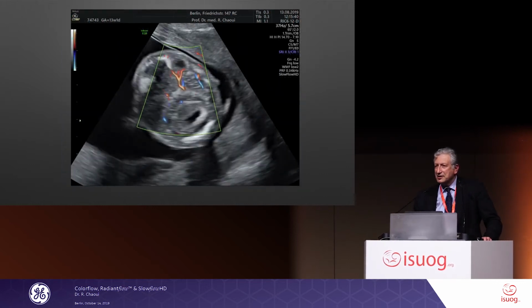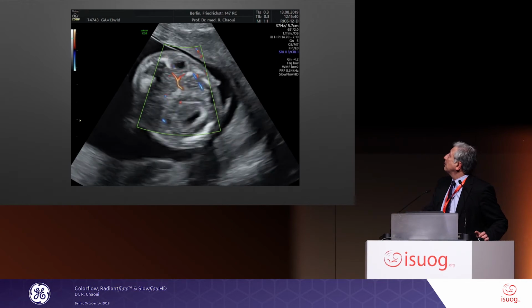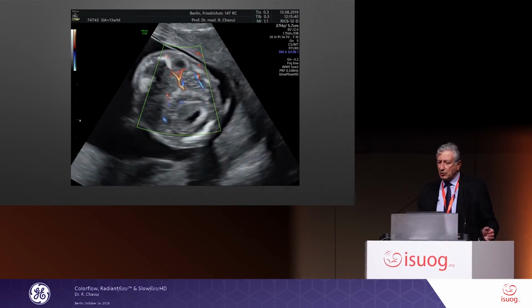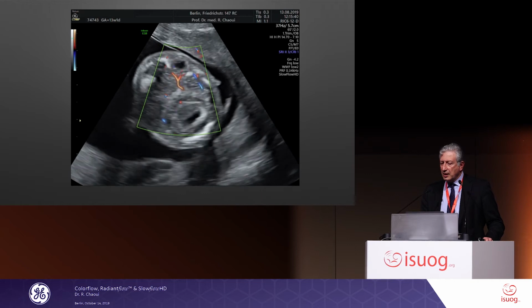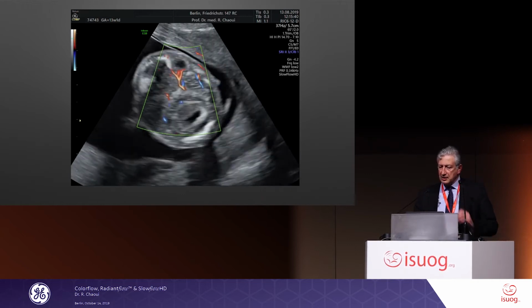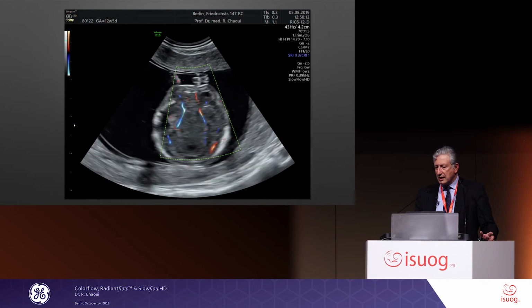So today, this morning, Ritsuko, who's sitting here in the audience, showed a case of the hyaloid artery in early gestation, and she was showing that it is abnormal in holoprosencephaly. And personally, when I have a fetus with severe abnormalities going into termination, I'm always trying to find new fields, and this is here the hyaloid artery seen at 13 weeks. And she was telling us that this is a normal condition, that in cases with holoprosencephaly, this vessel looks abnormal. And Ritsuko, I have to tell you that you are right, because this is exactly what I observed.